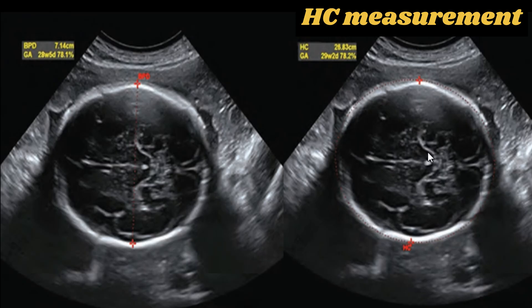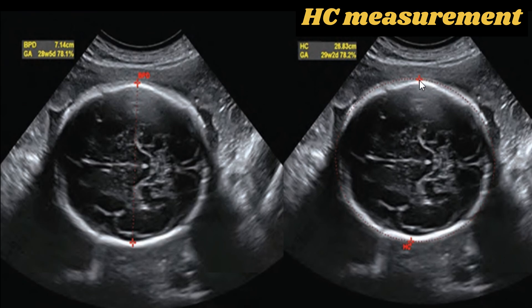Under these circumstances, head circumference may be more reliable than biparietal diameter for estimating gestational age. In this sonogram, we can see the measurement of the head circumference at the same axial level as the biparietal diameter, with calipers placed along the outer edges of the head.